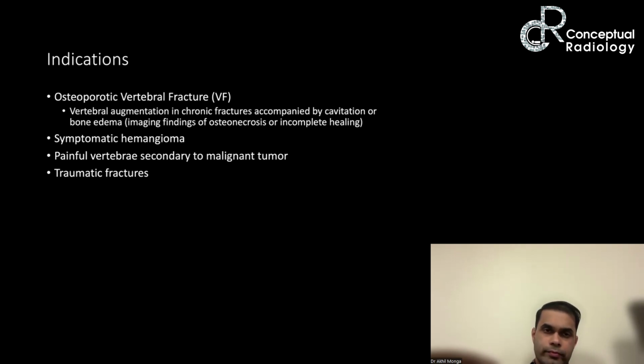And we see usually if it's not healing because of the imaging findings, STIR hyperintensity being there, or the patient's clinical condition is not improving. The second part is symptomatic hemangioma.